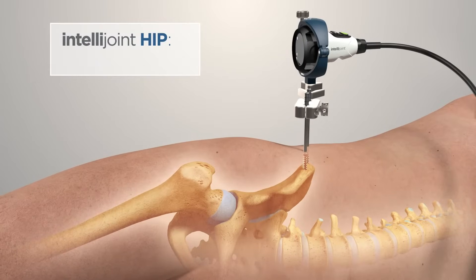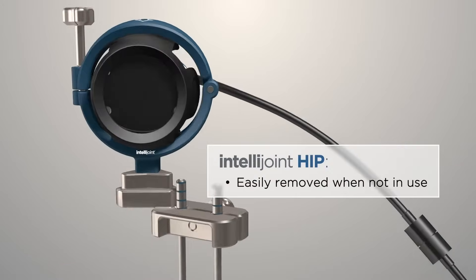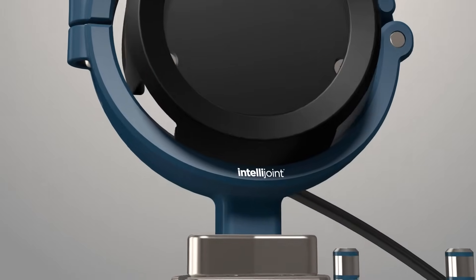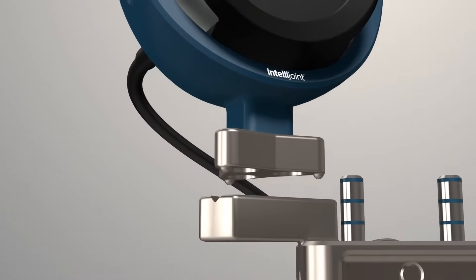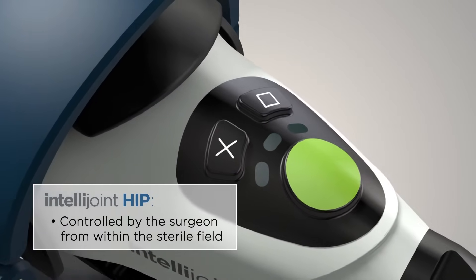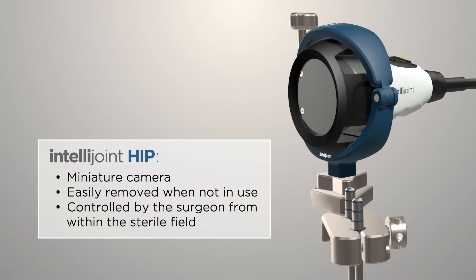IntelliJoint Surgical's breakthrough technology is encapsulated in a single miniature camera that is attached directly to the pelvis. The camera can be easily removed via magnetic mounts when not in use, to eliminate any interference with the surgical workflow. The IntelliJoint HIP system can be controlled by the surgeon using the buttons on the camera from within the sterile field, without the need to engage additional staff.